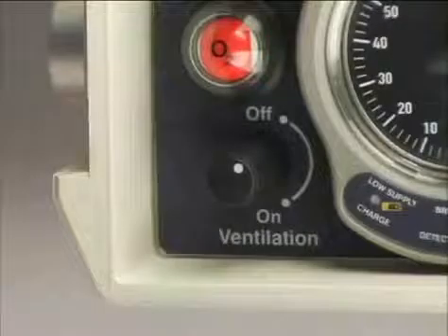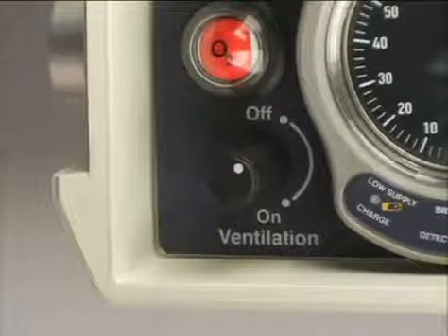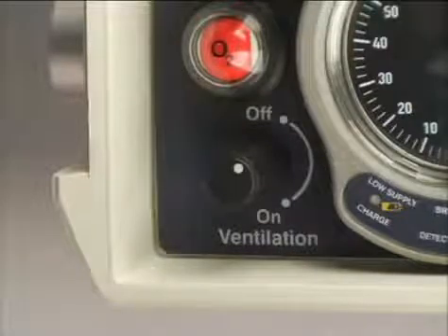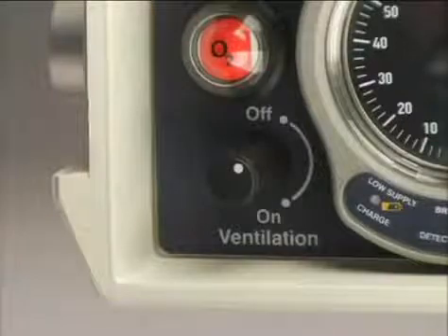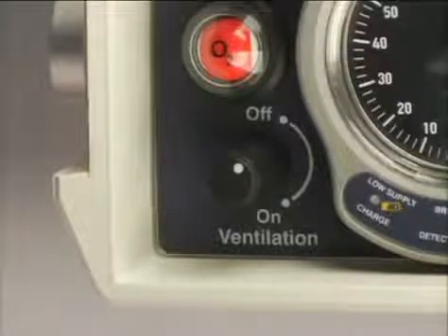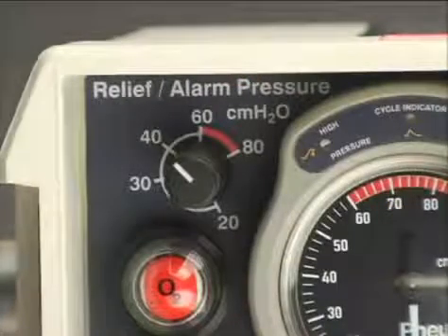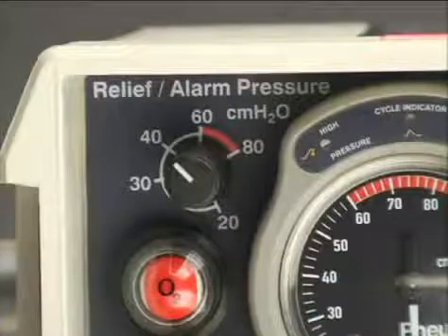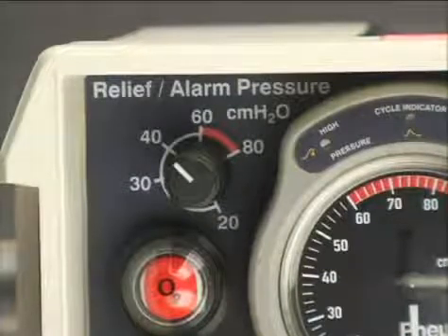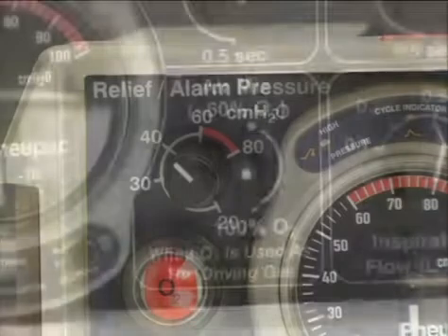This knob operates the main pneumatic switch. Select On to provide controlled mandatory ventilation to non-breathing patients. If a patient begins spontaneous breathing at an adequate level, you can easily turn ventilation off, allowing them to breathe 100% oxygen on their own through the internal demand valve. This rotary control knob lets you set the relief pressure valve to continuously adjust maximum patient inflation pressure from 20 to 80 centimeters of water pressure.